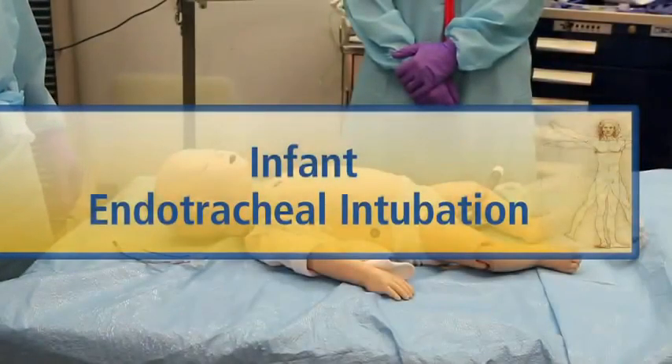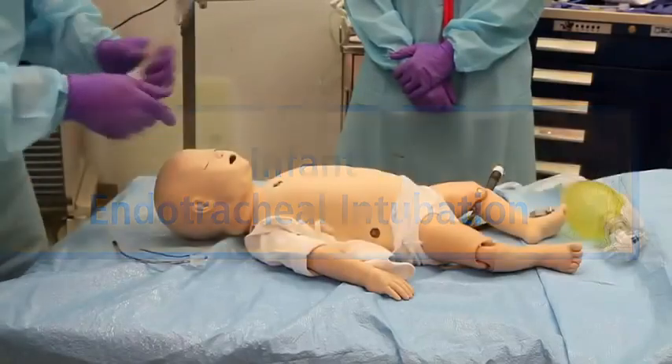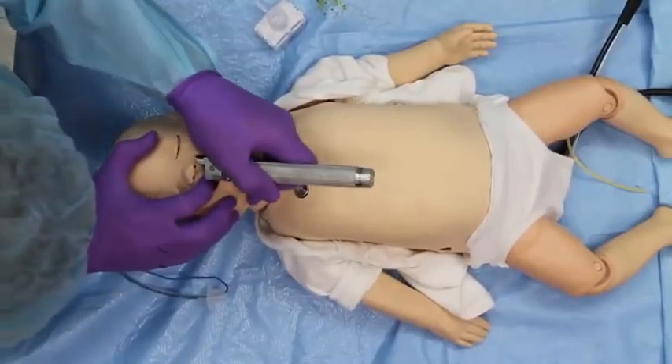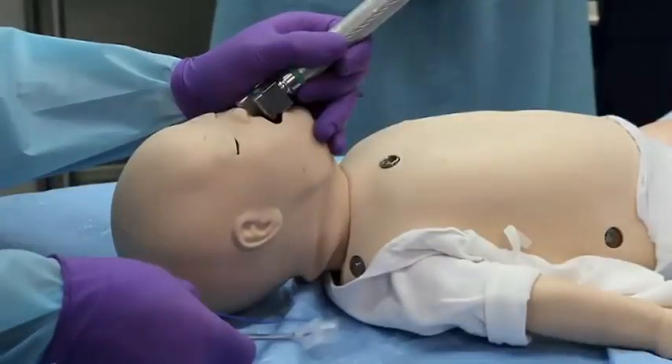Make sure the patient's neck is not hyperextended or hyperflexed during the procedure. Hold the laryngoscope in your left hand. Insert the laryngoscope blade into the right side of the patient's mouth, moving the tongue to the left.